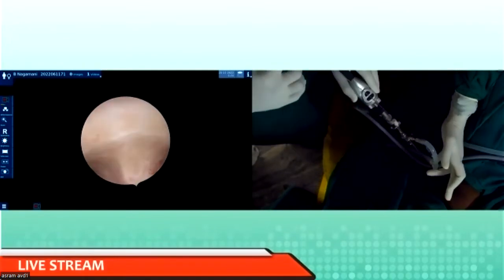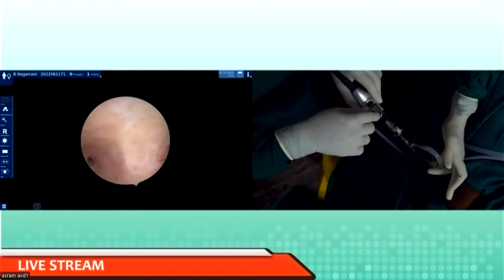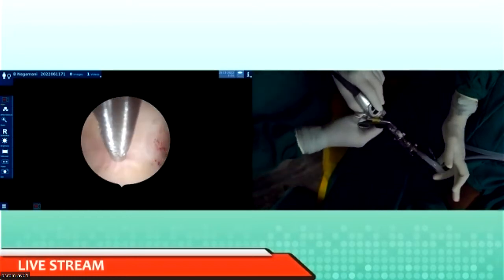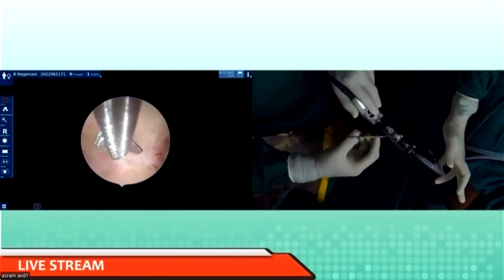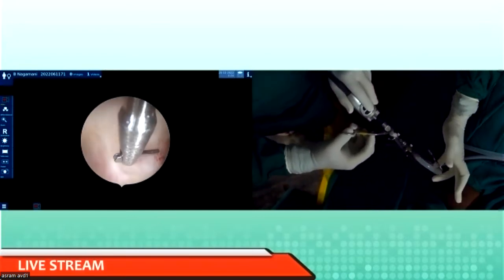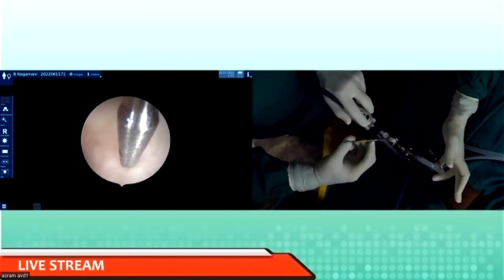Now look at that. I am standing. There is no hard and fast rule that you have to sit and do the hysteroscopy. Can you see that? Now you slowly push in your scissors. Now get your landmarks properly. So now this is the scissors, and you just cut it. This is just for the demonstration of the septal resection. Can you see that? This is how you cut it.